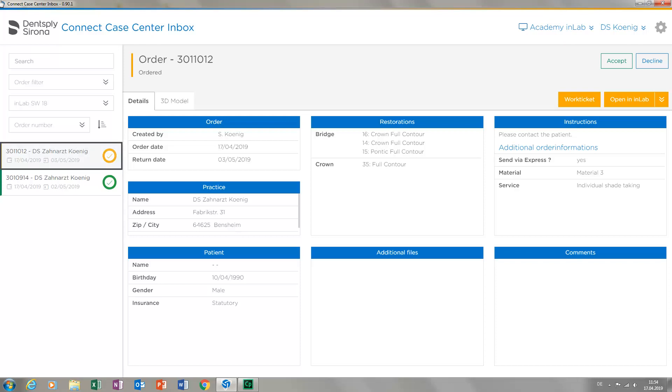We will wait until the case has been downloaded and then click the button 3D model.